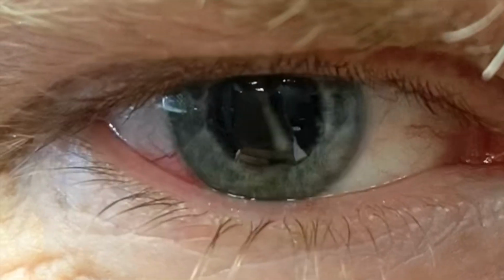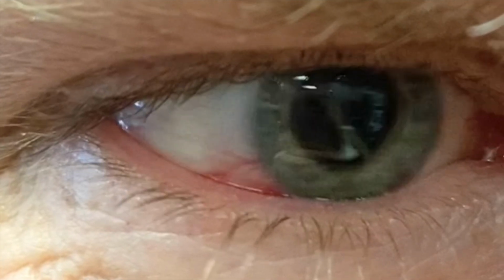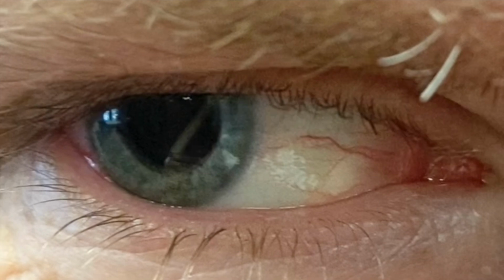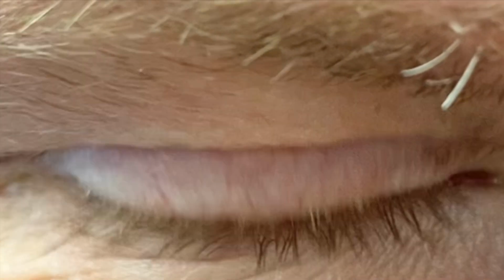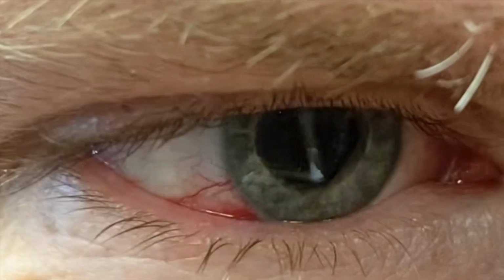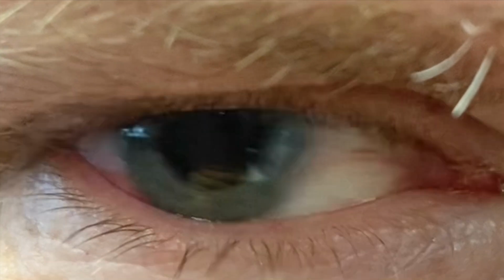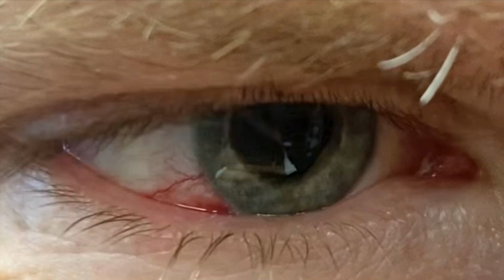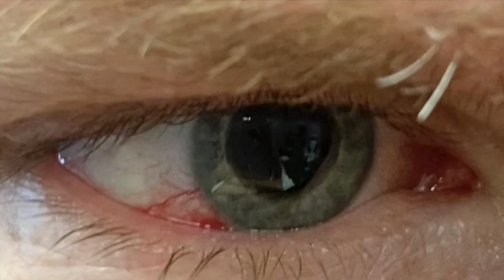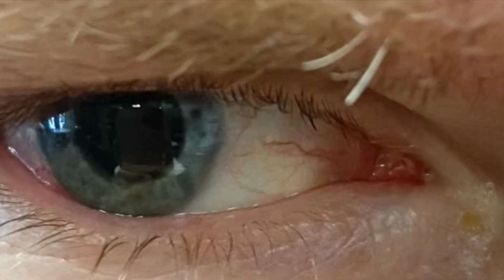Okay, so the other cool thing is that you can kind of see this implant because it can be located anywhere in the vitreous, and as a patient you can easily see this kind of rod-shaped floater sloshing around in your vision, the shadow. The eye doctor, when they see you, is going to be able to see this implant when they look inside your eye. And it's even possible to see this with the naked eye, especially if the pupil is dilated. For example, in this video here that you're watching, this is a video of the Ozurdex implant inside my eye. And it's pretty cool when you can see that little implant sloshing around inside your eye.